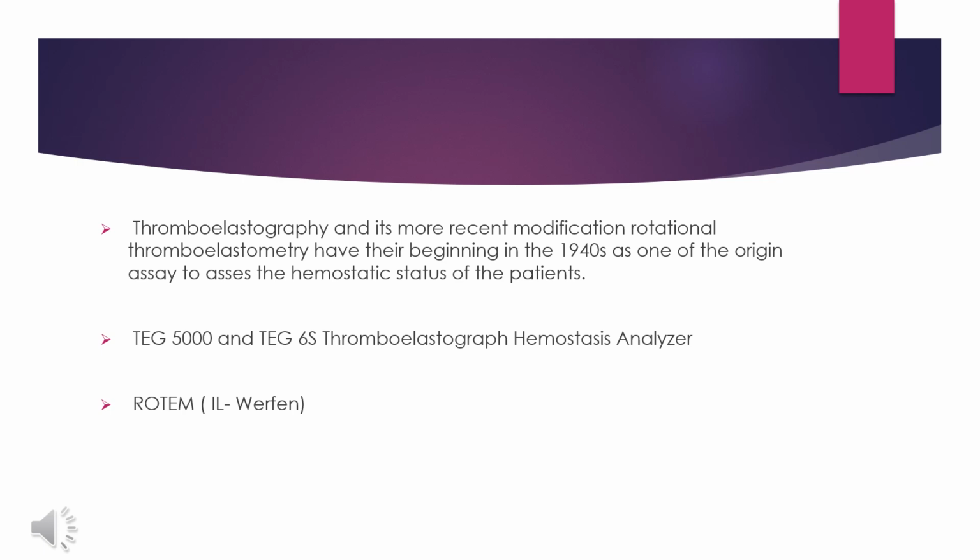So the TEG and the ROTEM are global whole blood analyzers that measure clotting time and the dynamics of clot formation and dissolution as affected by the kinetics of thrombin generation, platelet activation, fibrin generation, the clot strength, the clot stability, and the inhibitory effects on any aspect.